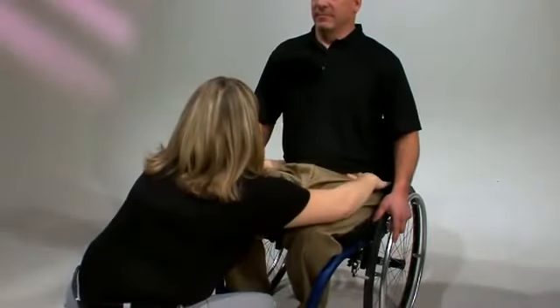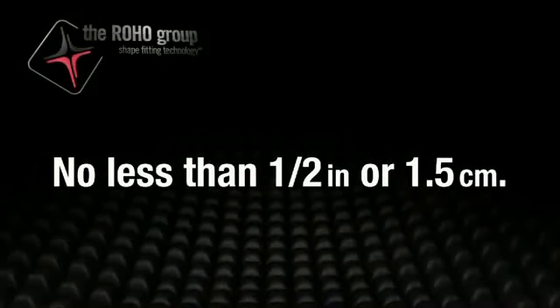Once you have the individual in the desired position, lock the isoflow by pushing the red knob to the left into the locked position. Once you have finished, please remember to check the client's bony prominences again to double check that neither side is lower than the recommended half inch (1.5 centimeters) of space between the user and the bottom of the cushion.